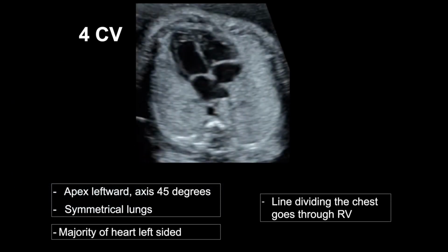The next step with thinking about the 4-chamber view, or doing your echo in general, is to not get tunnel vision too quickly. When you sweep up to the chest and get into your 4-chamber view, you're doing a global assessment. Is the heart on the left side of the chest? Is the axis 45 degrees? Do the lungs look symmetric? Is the majority of the heart on the left side?